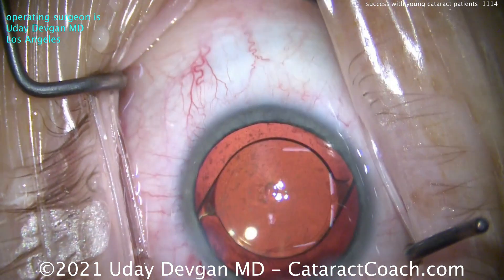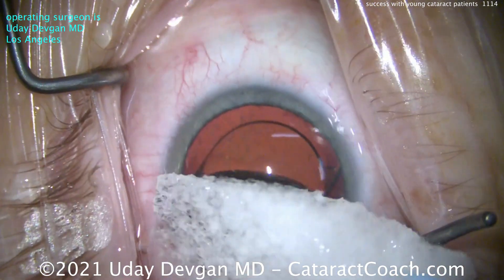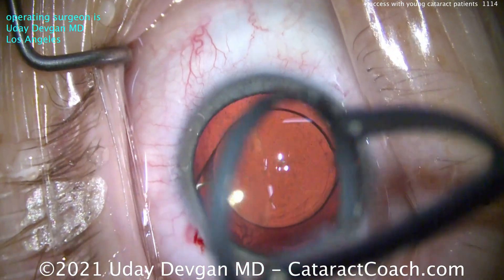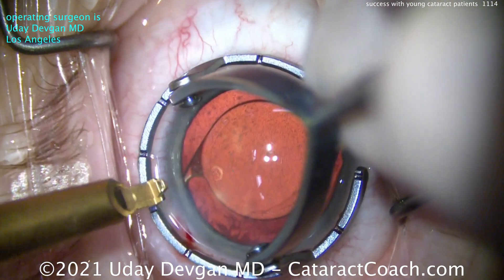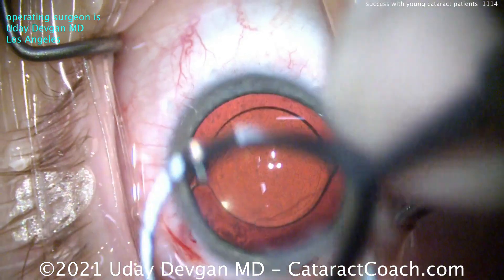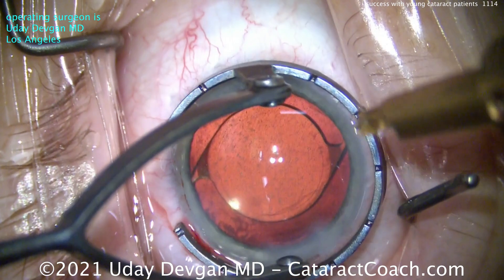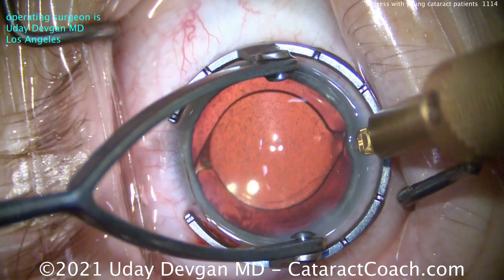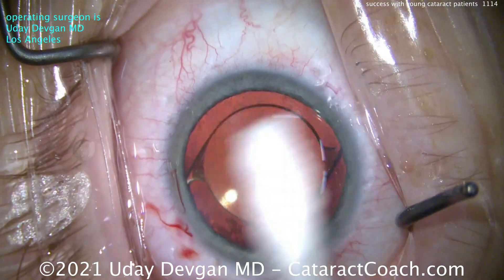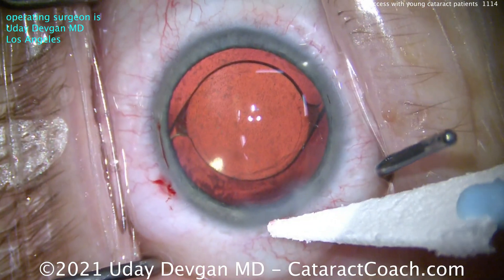We're not quite done yet — the patient has a small degree of astigmatism, steep at about 90 degrees, only about a half diopter. So that's a sponge soaked in tetracaine right there to get a little anesthetic going. Make sure the eye's nice and numb. Here's the fixation ring, lining it up at the 90-degree meridian. We're going to do a very small LRI arc right there — beautiful. Let's switch hands and flip that around and do a matching one here, and that should really neutralize the astigmatism beautifully. Fantastic case — it went beautifully, and I'm so proud to say I did beautiful surgery for this young patient.